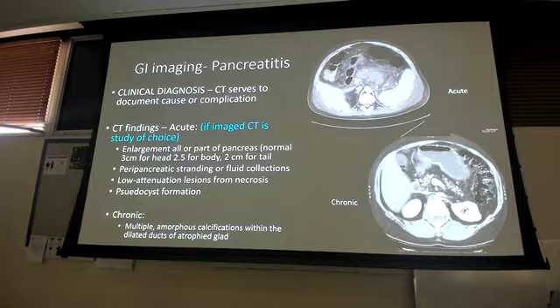I was already convinced based off the vignette that I was thinking about pancreatitis. And now I have all this inflammation and fat stranding that we talked about on the image in that region too. All the image really does is help confirm that you were suspecting pancreatitis from the vignette. But I can't give you just this picture and say, what's wrong with the patient? You're not there yet. Eventually in clinic, you may be able to pull this out, but not right now. I need to give you a vignette. Does that answer your concern for the most part? Excellent.